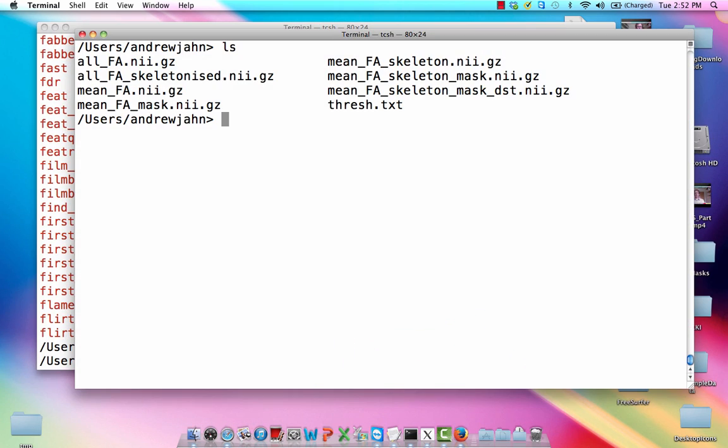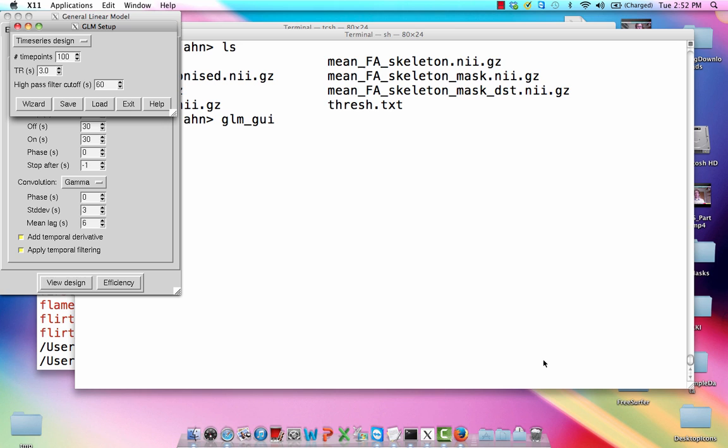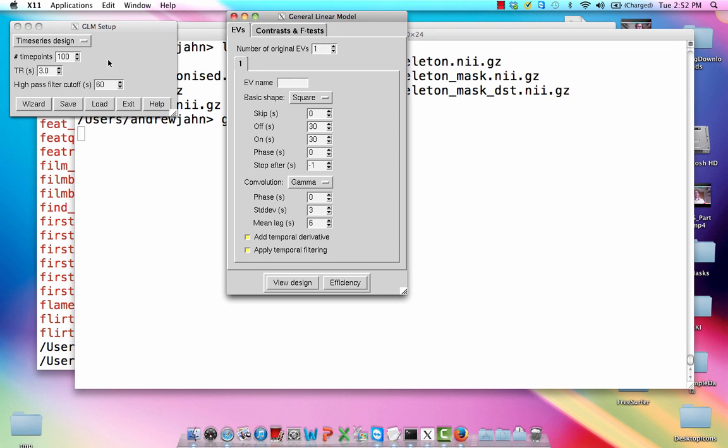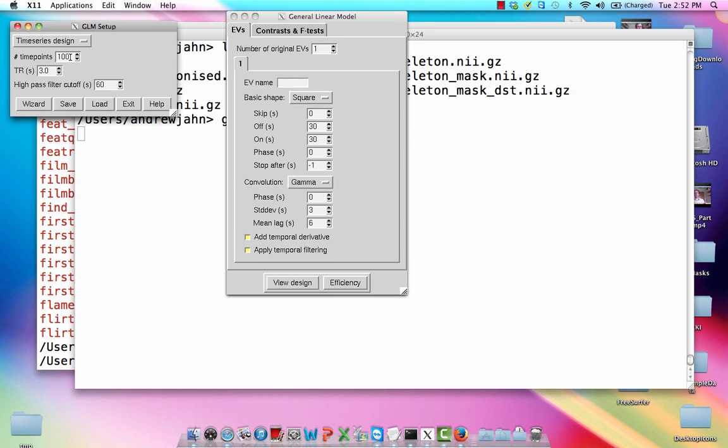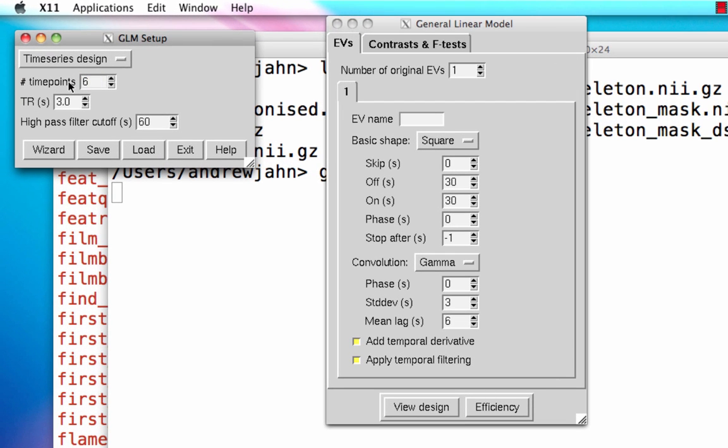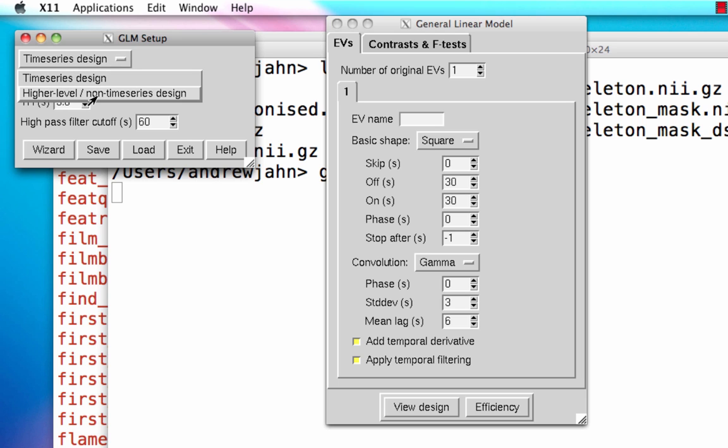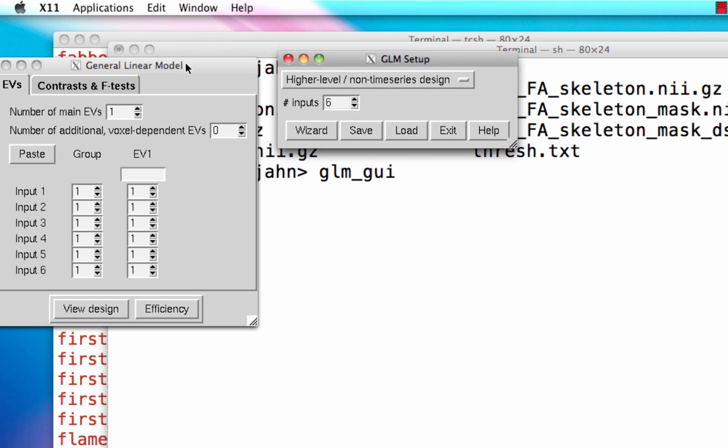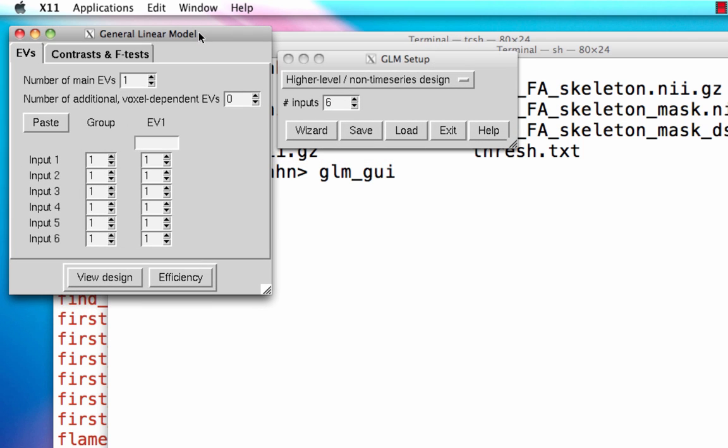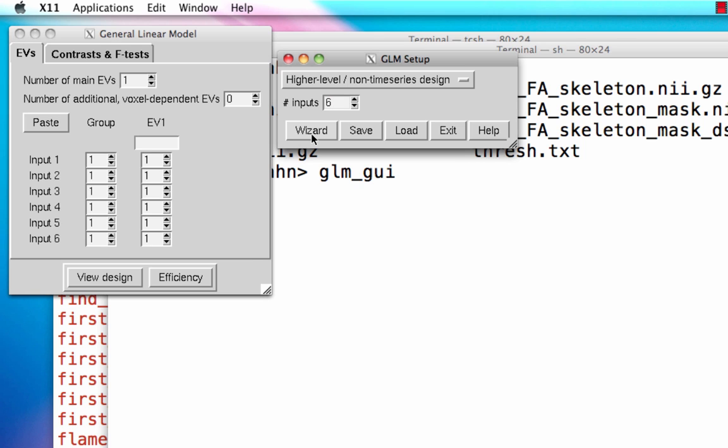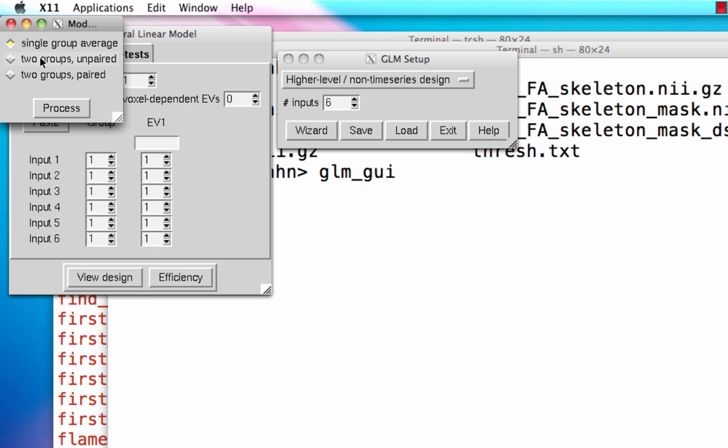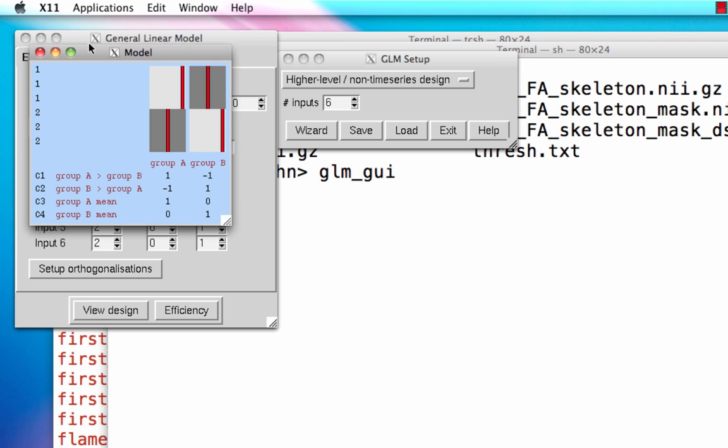So now we are within this stats dataset and we're going to set up a GLM just like we would with any other type of analysis. We want to set up a design and a contrast file so that we can carry out our contrast. Once you load up GLM GUI, select higher level design because we are carrying out a second level analysis. We have all of our subjects processed - there are only six in this example dataset, so you would change that based on how many people that you have. Next, click on wizard just to make life easy. And two groups unpaired - we're just contrasting three people in each group against each other. So a number of people in the first group, three, process and everything gets generated for you.